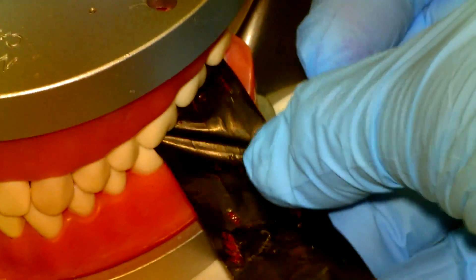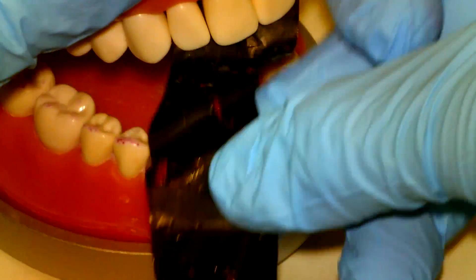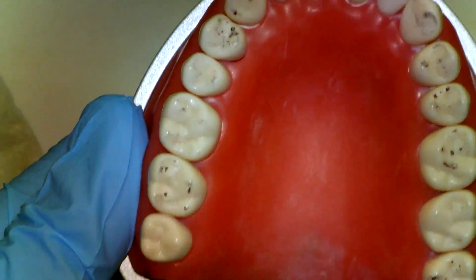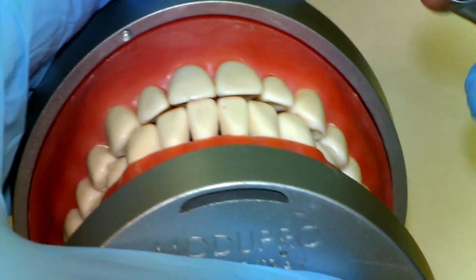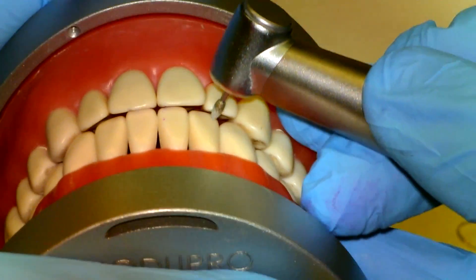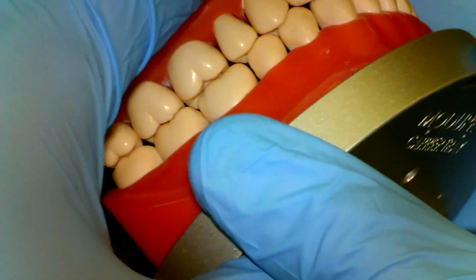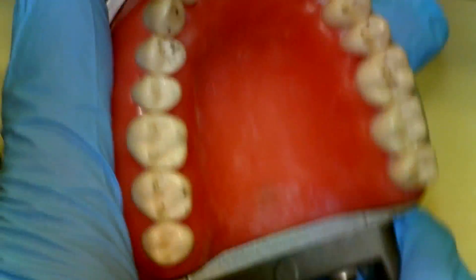Let's test the intensity of how this paper holds. It's definitely holding in the centrals, holding in this canine area, and holding here. A little bit light in the posterior. Sometimes it's good to have your typodont close together to see where teeth like this lateral area still need quite a bit more adjustment to come into contact. There's a limit to how well we can equilibrate these typodont teeth, but going back to criteria, we want to see sufficient anterior and posterior marks — and this definitely fulfills our requirement for the number of marks in the anterior and posterior.